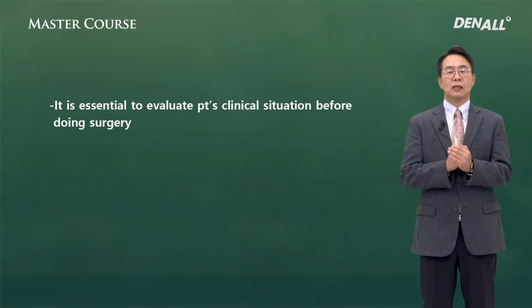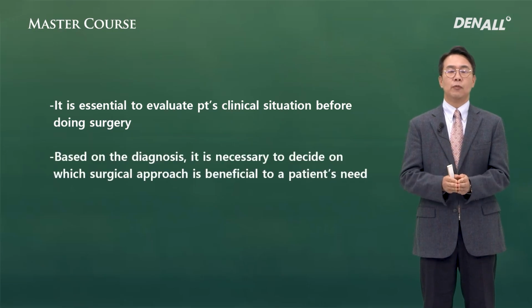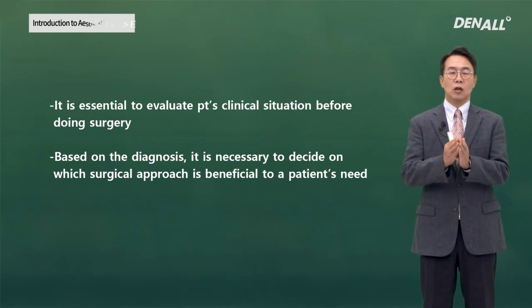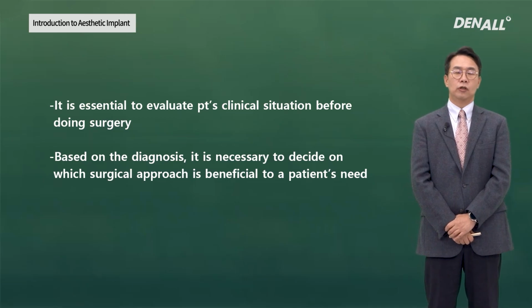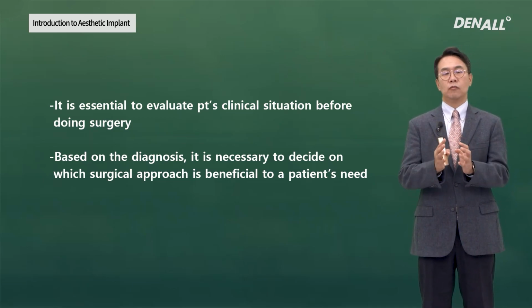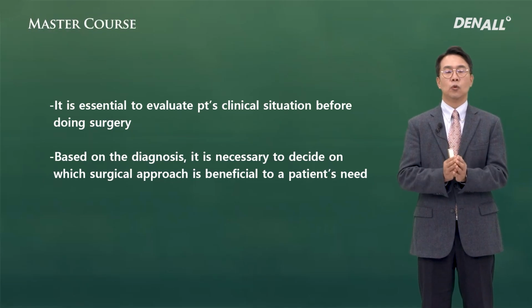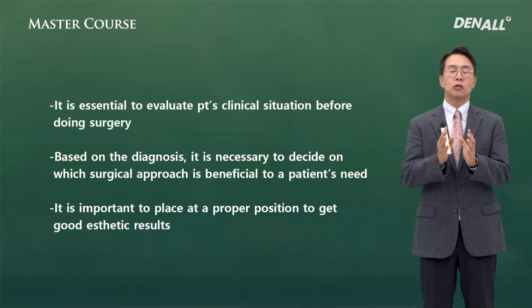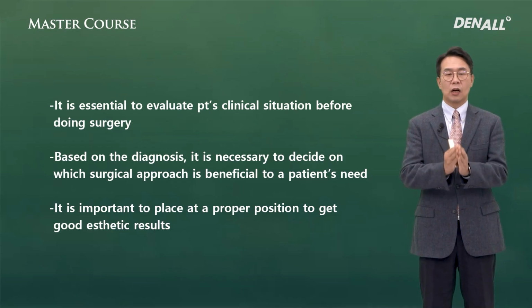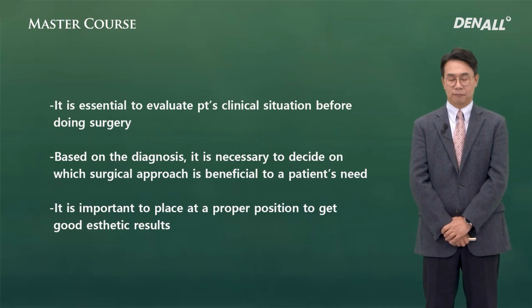It is essential to evaluate patients' clinical situation before doing surgery. And the basis is diagnosis. It is necessary to decide on which surgical approach is beneficial to a patient's need. This is the shortcut to realize the expectations of a patient. It is important to place at a proper position to get good aesthetic results based on the diagnosis.